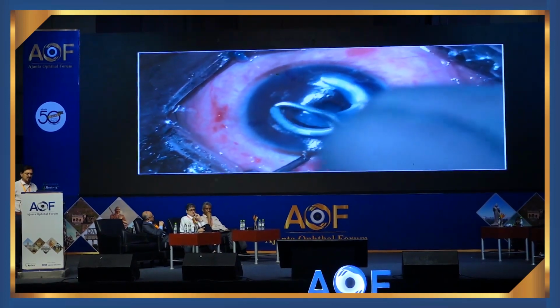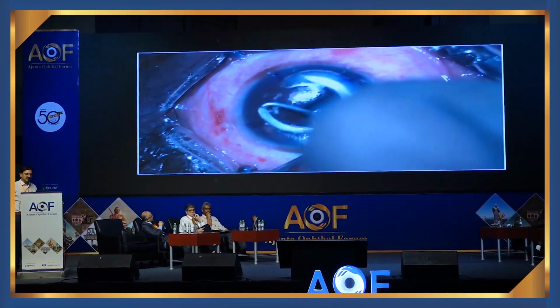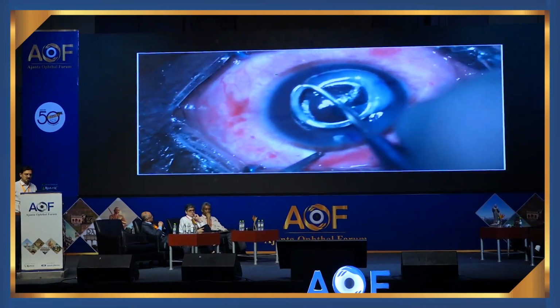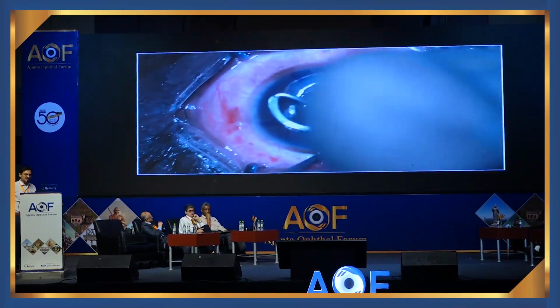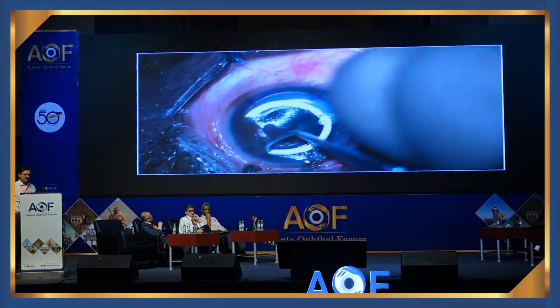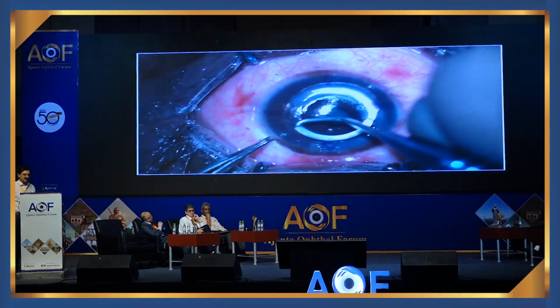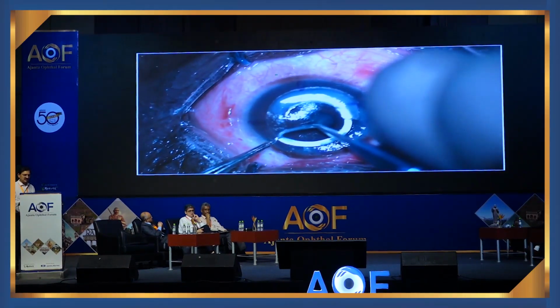This is actually an Intacs channel maker. I had a few in my OT. I use them to rotate these segments into the channel. It goes very nicely. In the initial few cases we feel a little bit anxious. After that it's very easy. It takes a few minutes to perform this surgery.